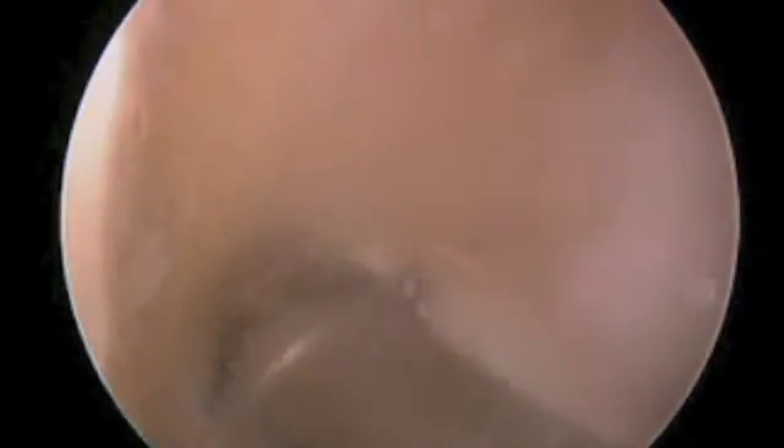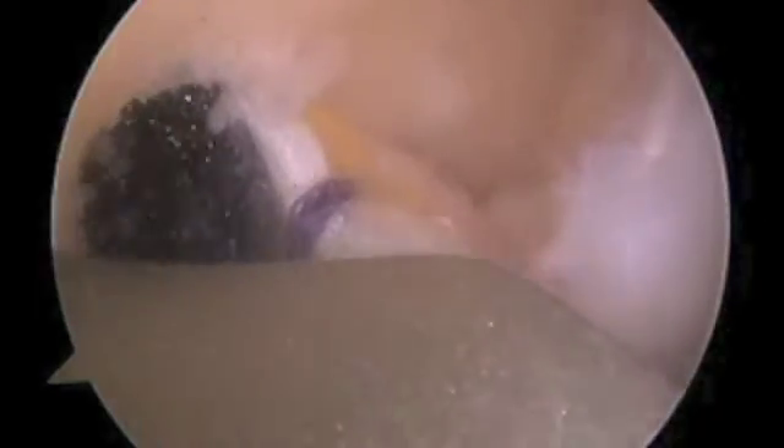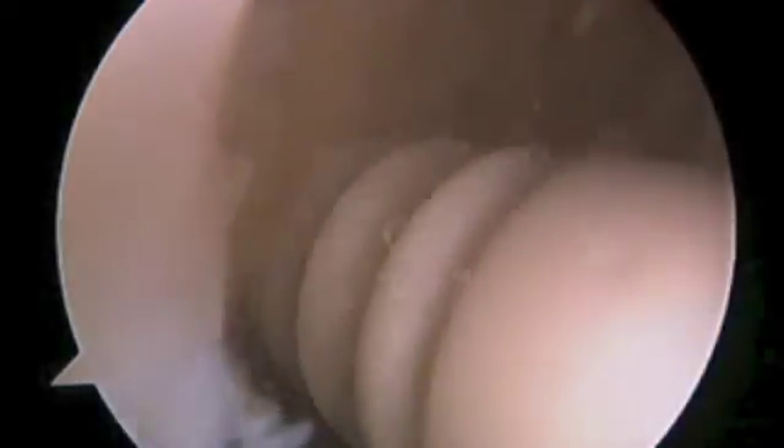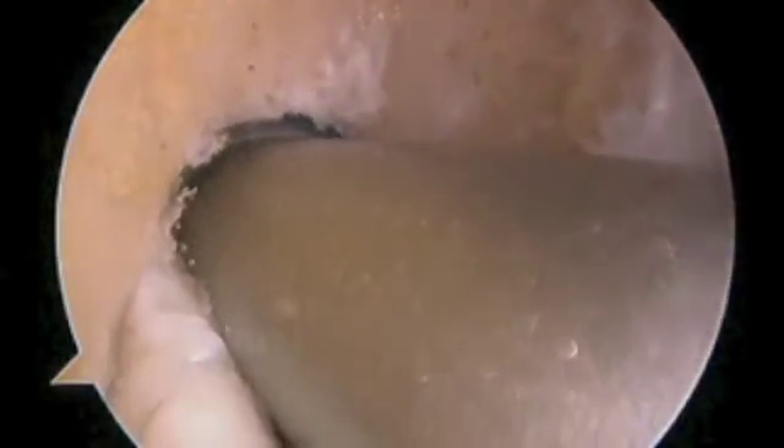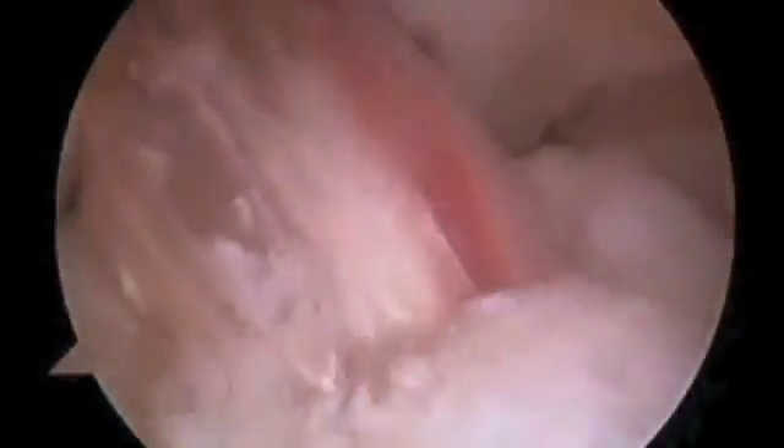You don't get tunnel widening. In this particular case with this technique, there's a dilator followed by a sheath. Once this sheath is impacted, through the anterior medial portal you're using the same pathway, so there's no divergence of any fixation device. We use a little tissue protector to protect the graft. This is a PEEK screw that I like to use — similar biomechanical properties to bone. I don't like bioabsorbable fixation devices for various reasons, but this gets away from metal devices altogether, and you're not worried about winding the graft up. This sheath pushes one bundle — the anterior medial bundle — in fairly, and like the posterolateral bundle pushes one bundle anterior medially, and you get a nice aperture secure fixation without damage to the graft.